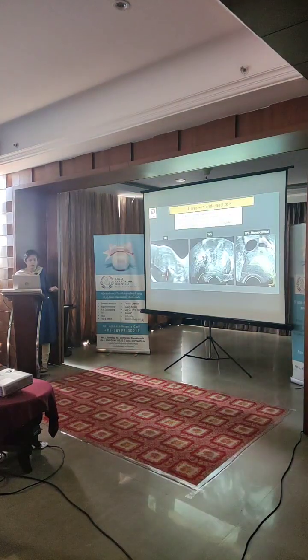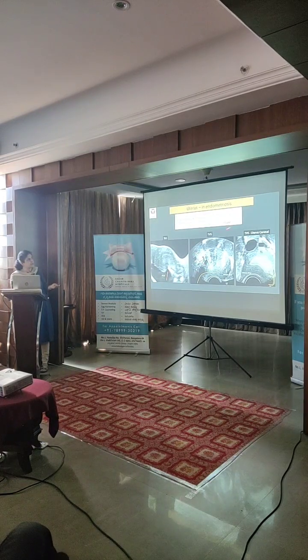So this adenomyosis that is seen because endometrium is entering the myometrium not from the endometrium, but it's entering it from the serosal surface of the uterus because of chocolate cysts, because of deposits in the pouch of Douglas. So this adenomyosis affects only the outer portion of the myometrium, and this is called FOAM. FOAM stands for focal outer adenomyosis of the myometrium, and this is a feature that this patient is very likely to have deep endometriosis of the posterior compartment.